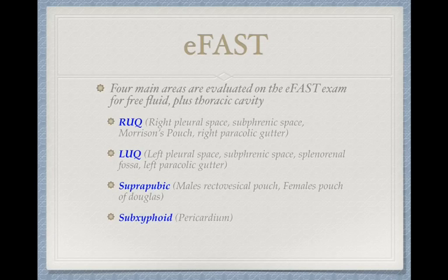Then we go to the suprapubic area to look behind the bladder for free fluid as well, and then move up to the subxiphoid space. And the extended piece of this is that we're also going to be evaluating for those pleural effusions, but then in addition to that for pneumothoraces.